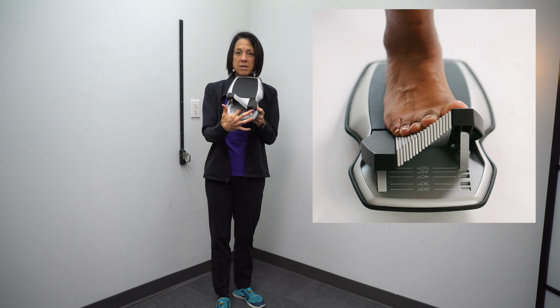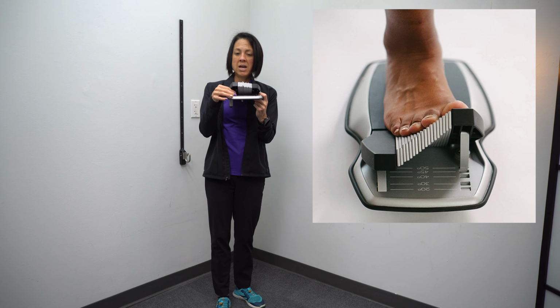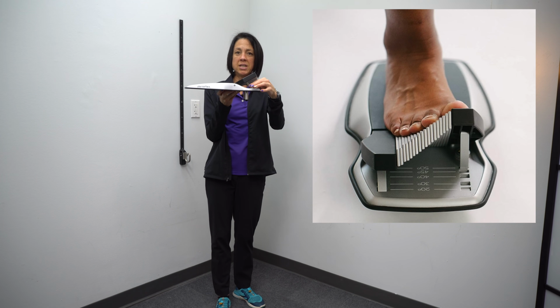And then in addition to that, underneath here, I don't know if you can see it, but there are numbers on here, so it will tell you the angle that this is up. There's little numbers down here, and whatever notch you put it in, it tells you how many degrees of extension you're getting. So if you're someone that wants to track your progress, numbers are always great for that.